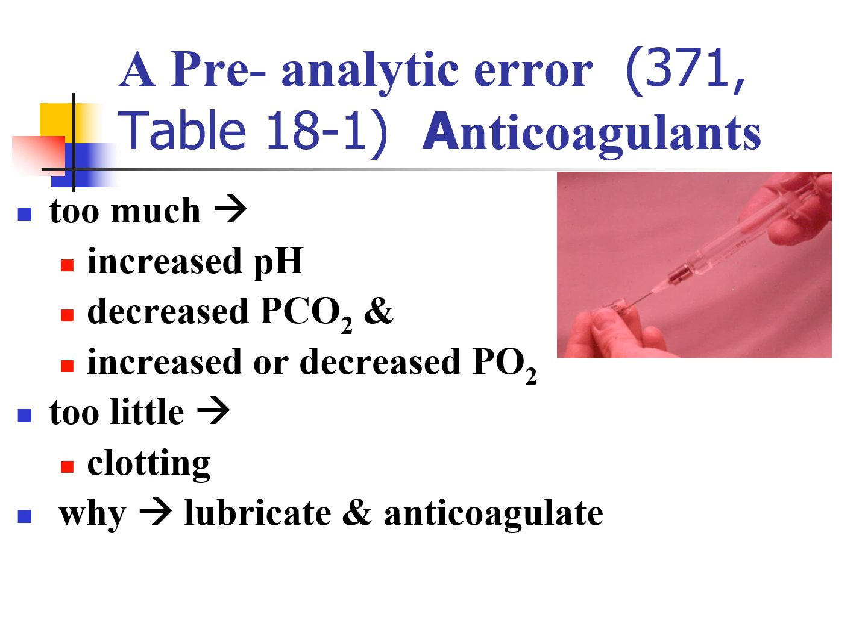So the big thing here is that heparin will help lubricate the inside of the syringe. It'll anticoagulate, so it helps prevent the blood from clotting, but it also lubricates the syringe so that when we have the arterial pressure pushing, it will actually push itself out, so we don't have the opportunity for an air bubble to be introduced.